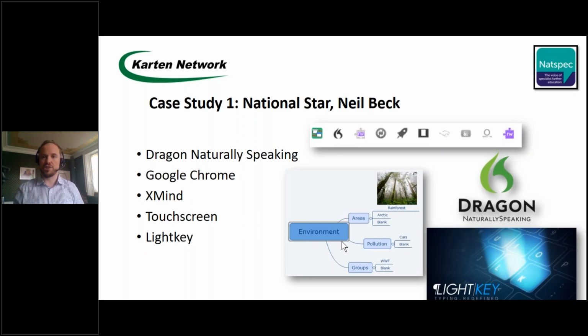The one thing to consider when you're using a touchscreen is to select things to open with a single click. So if you tap Windows and start typing in single click, it will give you an option there where you can choose to open things with just one tap rather than tapping twice, which might be quite difficult for students. So touchscreen definitely on the list.